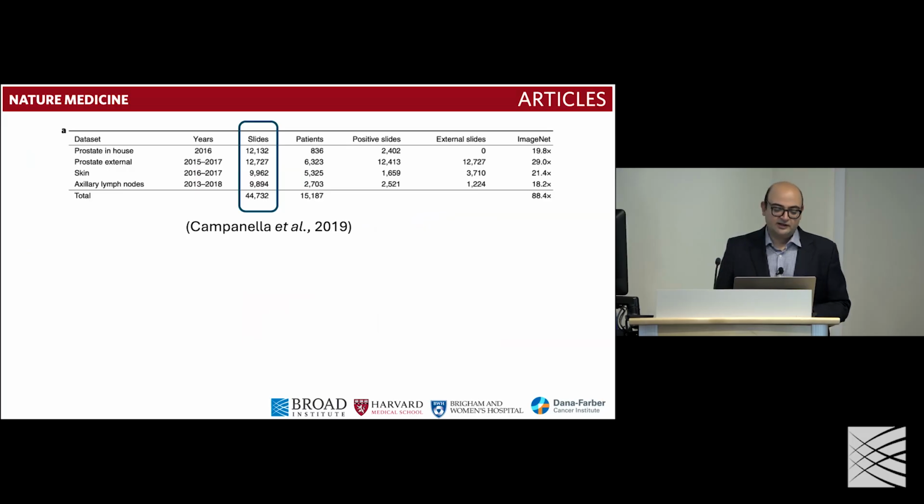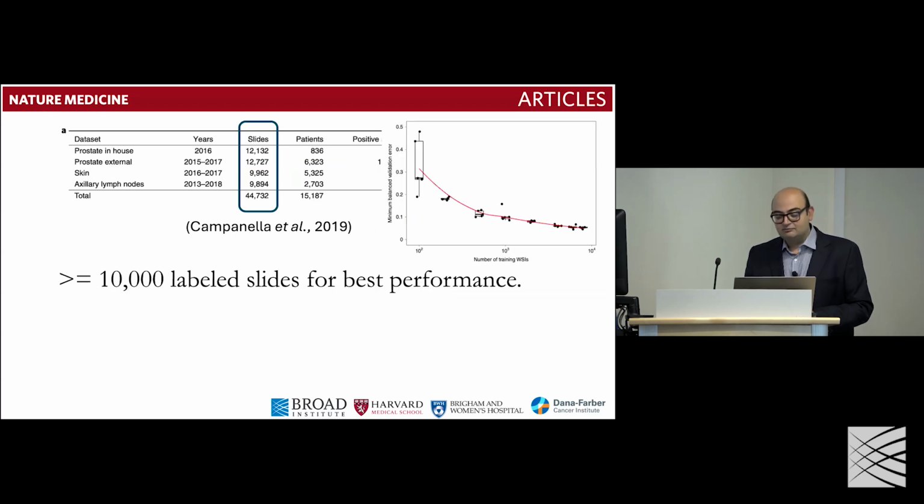And this is what was articulated in this 2019 really seminal study. It was published at the Memorial Sloan Kettering Cancer Center, where they showed that you needed about 10,000 whole slide images to get the same level of performance you would get with slide level labels. This is back in 2019, and they're focusing on targeting very fundamental problems like detection, subtyping, grading, and prognostication, right?